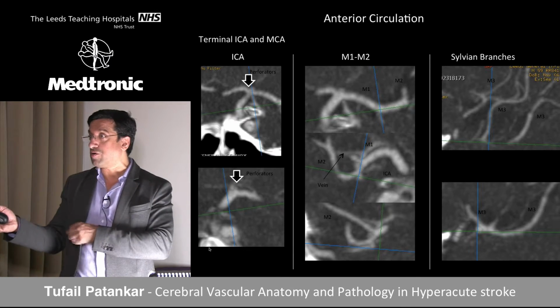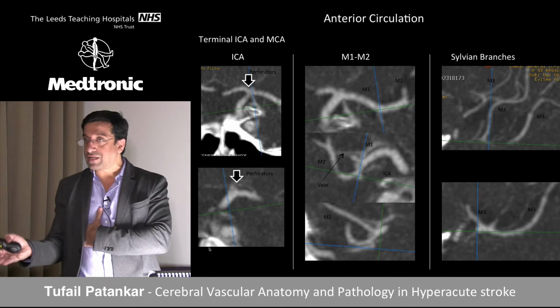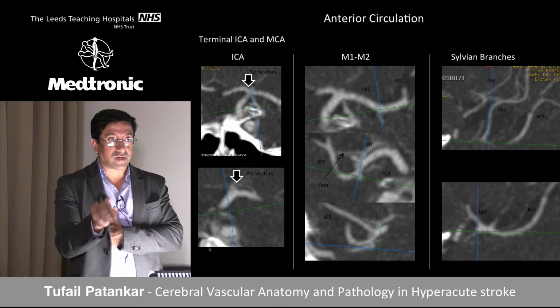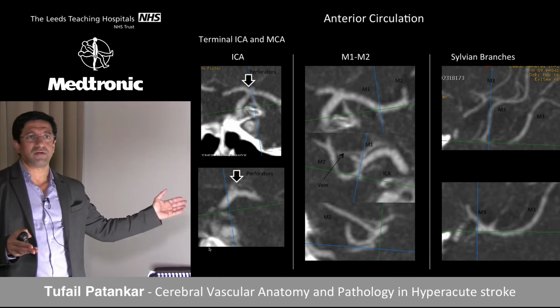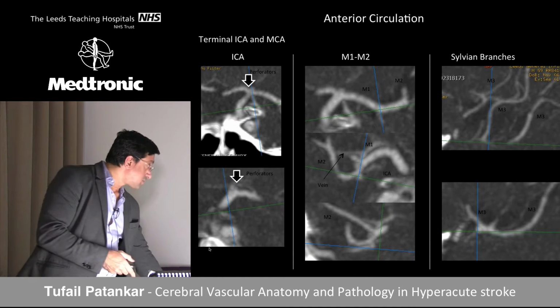Tommy Anderson in Stockholm, what did he do? He went to the centers of the stroke physicians and trained them on their workstations to look at the CTAs. It's easy. It'll take me one hour to train you guys on that.